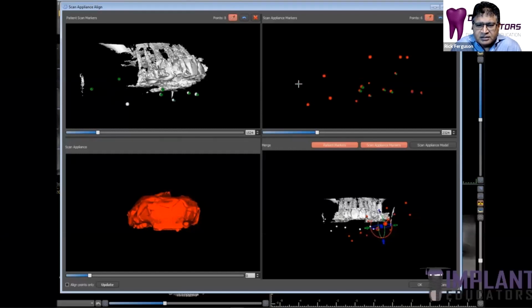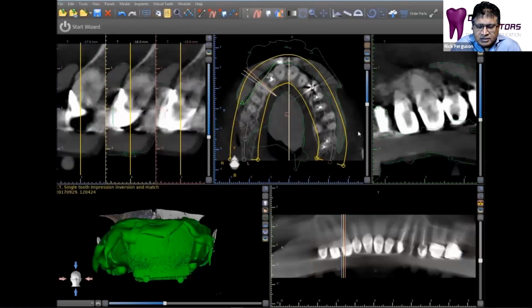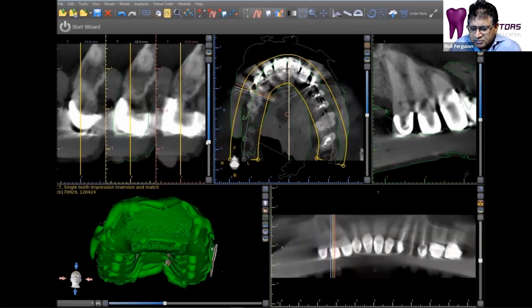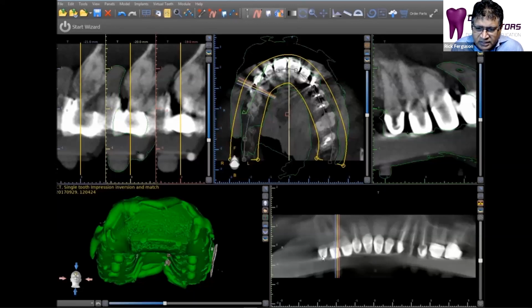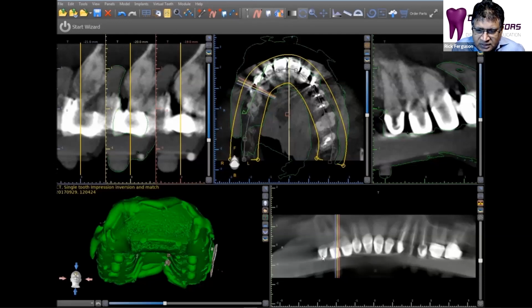And just by clicking on corresponding fiducial markers in both images, you can see how we can align them. Basically, what we have is the scan of the impression converted to a 3D file, an STL file, that is aligned to the jaw scan at a very low cost, because you're using tools or materials you already have in your practice. And this is very, very accurate. We use this for all types of cases, such as this one, where you can see the patient has a lot of metal crowns, which would prevent aligning an intraoral scan accurately to the DICOM data set.